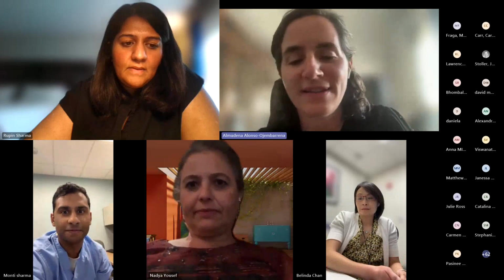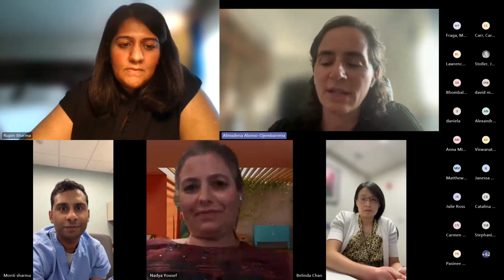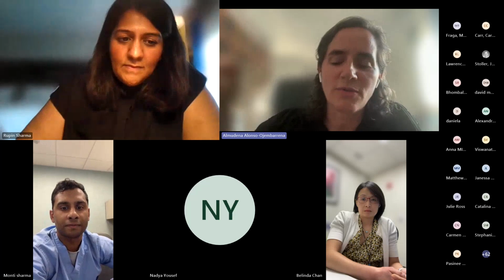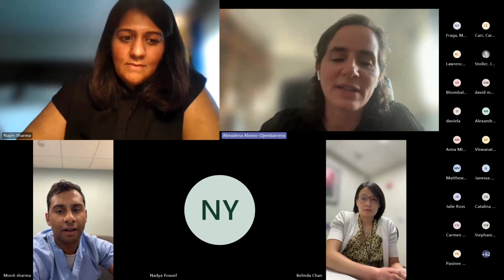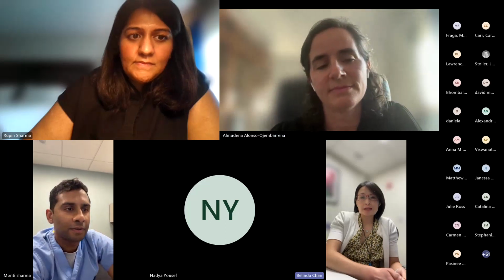No, I was just saying that this is true. This is a clinical question that many people, mostly at the beginning, perform, but maybe differentiating between 2 and 3 is not the most tricky thing. Maybe between 1 and 2 is more difficult sometimes. But for this purpose, I can say unofficially that there's actually nowadays an international consensus going on in which people from adult settings, neonatal, children, ICUs are getting to a final consensus of what's the final definition of 1, 2, 3. So maybe we will have more details to learn maybe at the end of this year. I think the data that Almudena presented kind of echo what the question stated, is there's a variation.